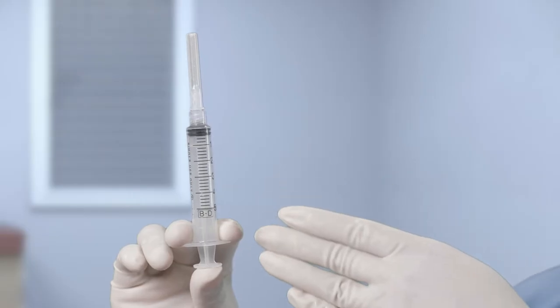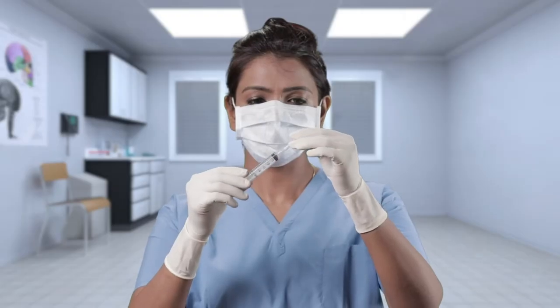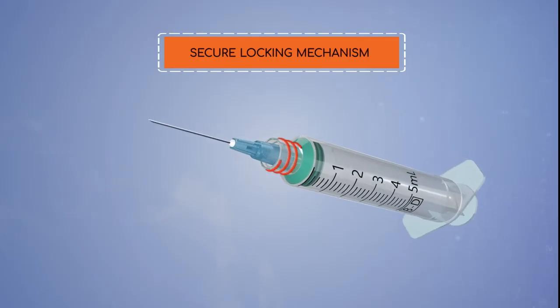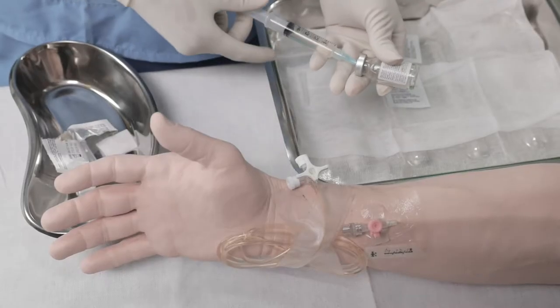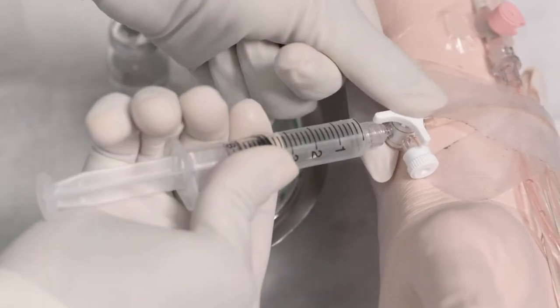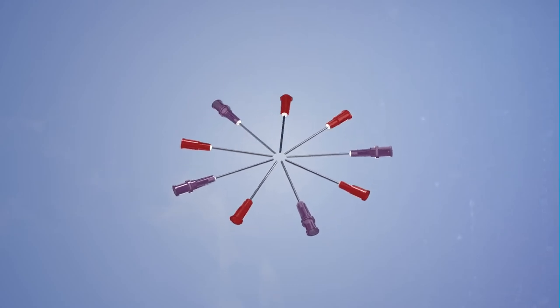The locking luer lock style syringes are more secure. The needles are inserted into the syringe and twisted to form a locked connection. The same is ensured when three-way connectors or catheters are fitted with a syringe.